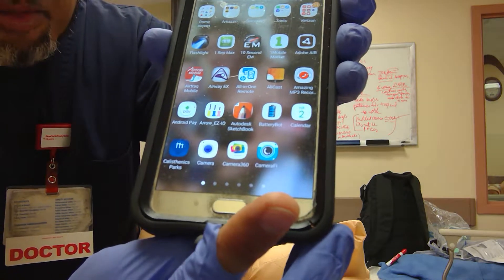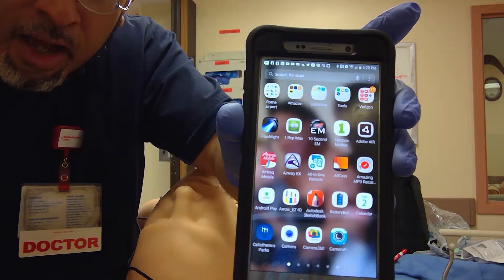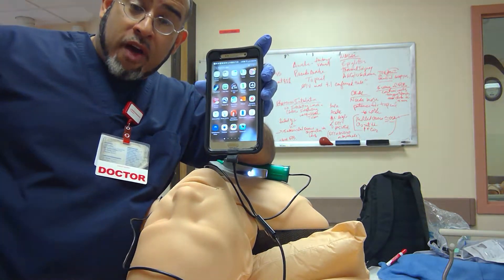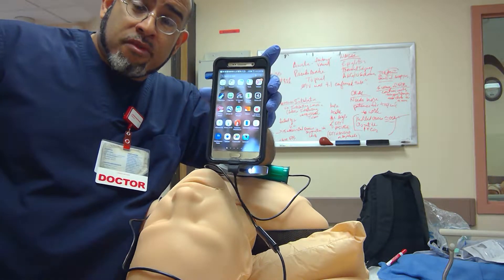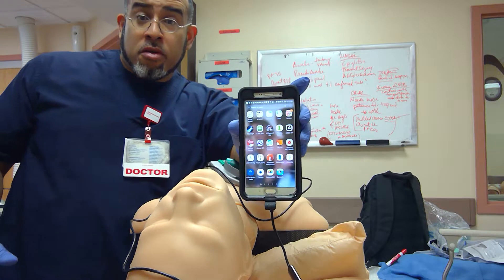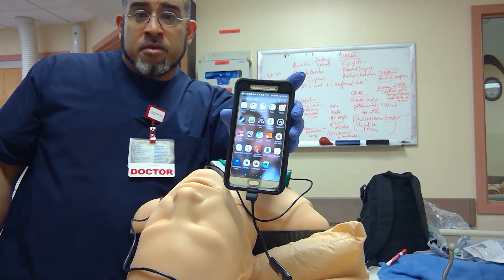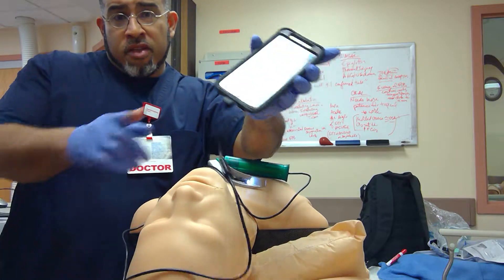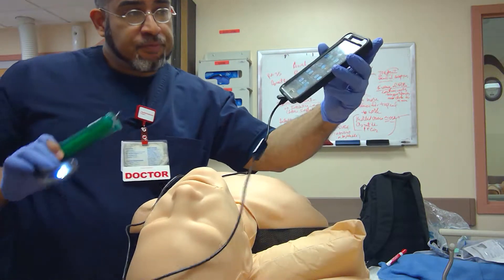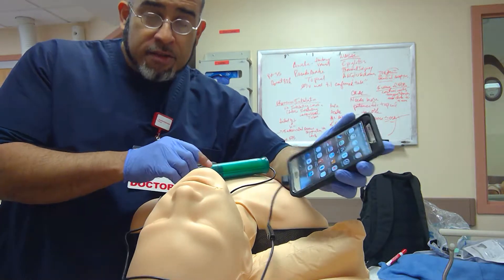The application is called Camera Fi. I purchased it for $7.99 so I can get rid of the watermark that says 'Camera Fi' and an advertisement for Amazon. This makes it easier to take pictures without the watermark or advertisement.